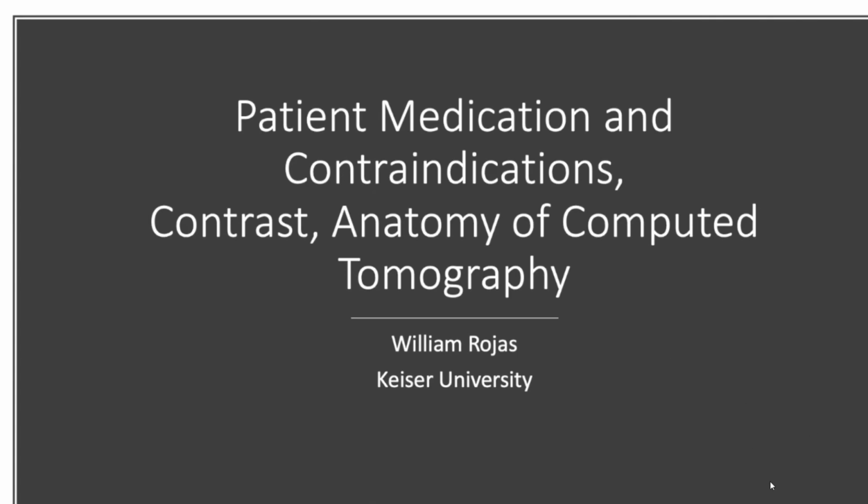Hello everybody, my name is William Rojas, and today I'm going to be doing a presentation on patient medication, pre-medication, contrast for CT, contraindications for CT, as well as some anatomy of some CT photos.